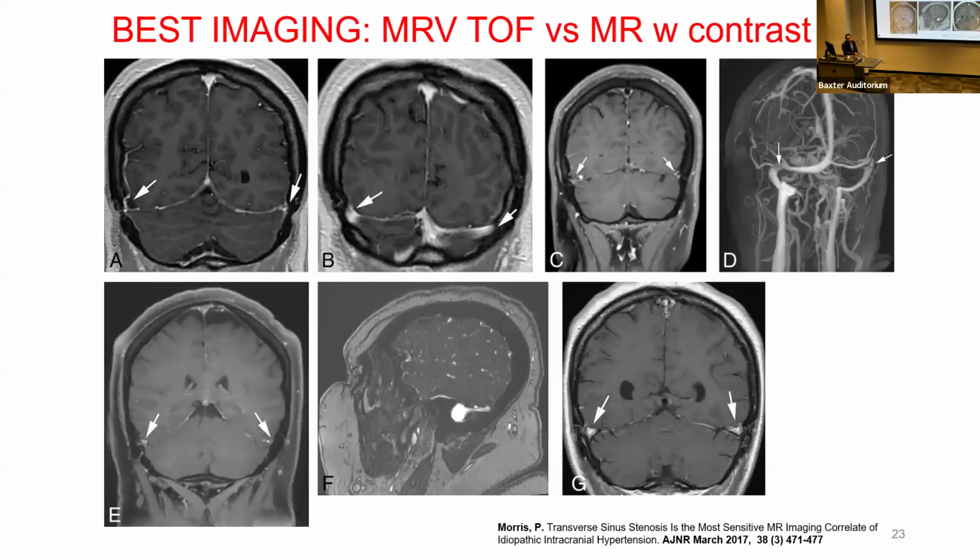Sometimes we see patients in the hospital who are admitted for vision loss. They do an LP, and the opening pressure is high, maybe 30 or 40. Obviously, they will call us a code stroke at the beginning. They did a CT, CTA, and the CTA at our center is a monophasic CTA, right? But sometimes we can see the veins. Ideally, we should have an arterial phase and a venous phase on CTA. We don't, but still you can see the veins. But then the next step when somebody sees possible IIH is ordering an MRV.